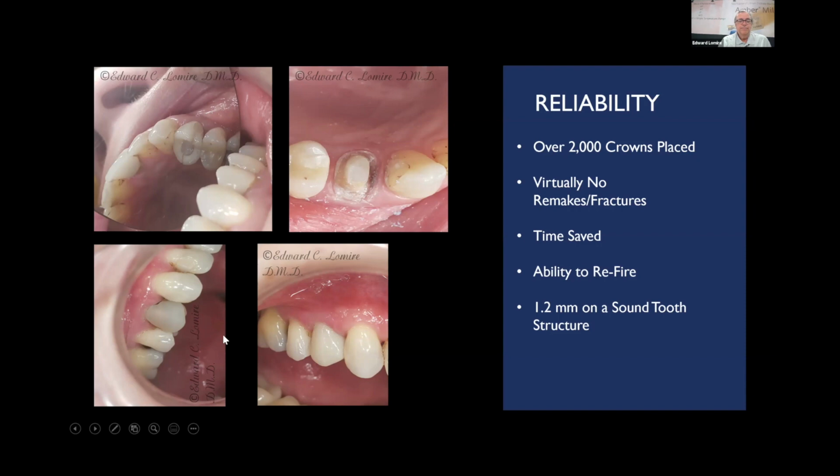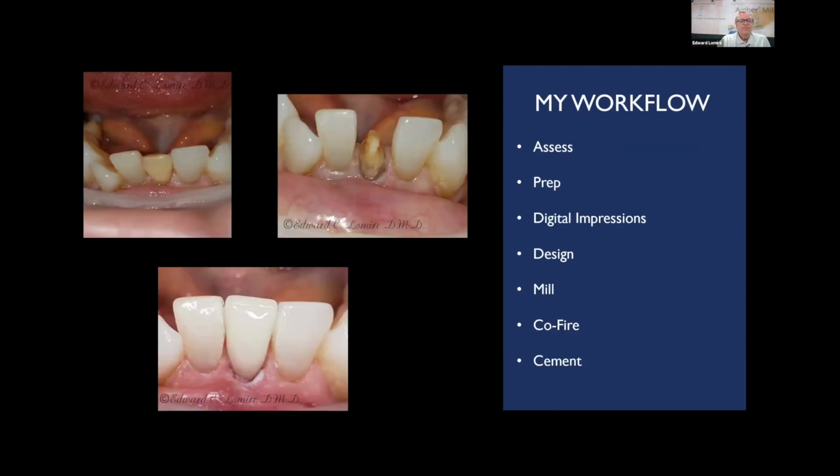And the other picture that we can see right about here, it was a try-in. This is the uncrystallized. And if you go over here, there we go, for our finished product. Shade-wise, I don't have it in hand, but I'm going to say that's an A2, and we probably fired that in an MT. In fact, I'm pretty certain that that was fired at an MT. There are 2 firing schedules. We'll talk about that later in part 2 of this webinar.